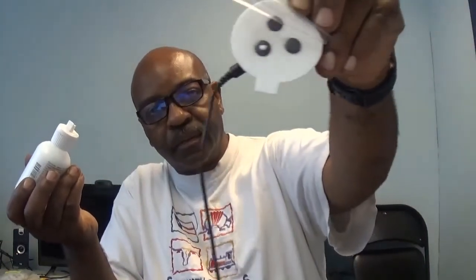These are designed to be able to be used dry, so you don't have to put any gel or cream on, but we like to add some anyway. Let me find my cream here. So this is the type that I would use, and I just put a small amount on the surface of these. That's about all I would put on, and I do that for all 3. And then you would just stick that on the area that you want to place it on.